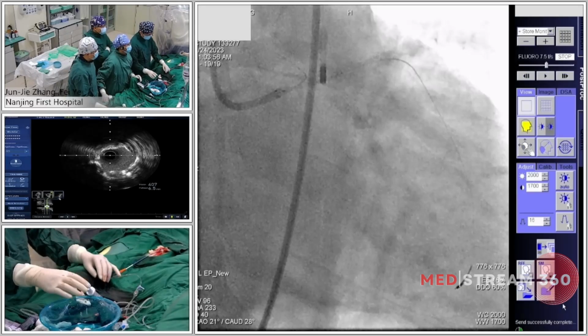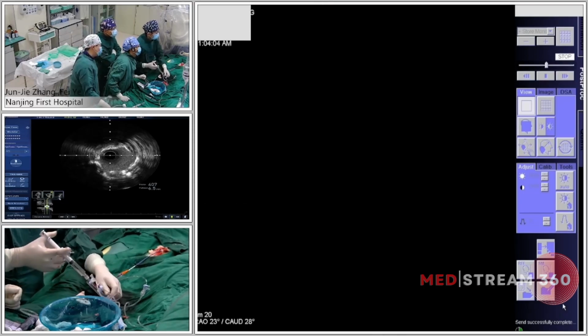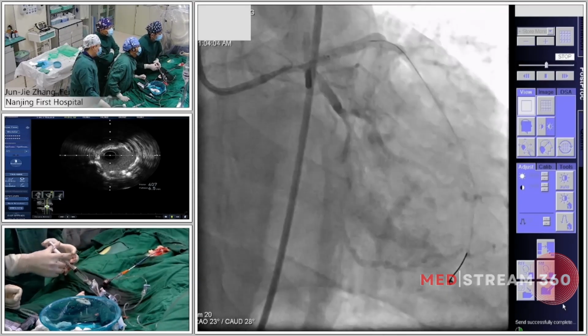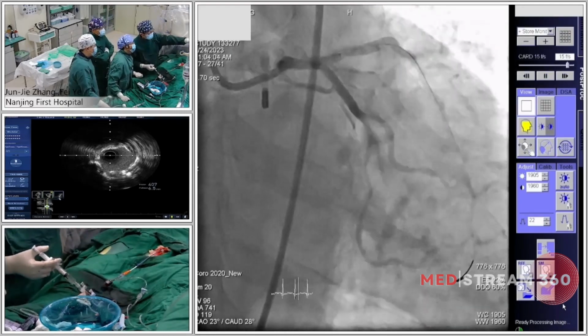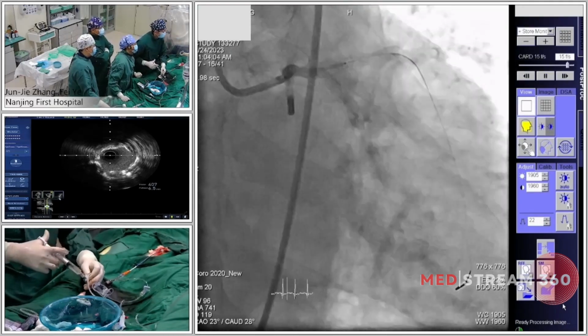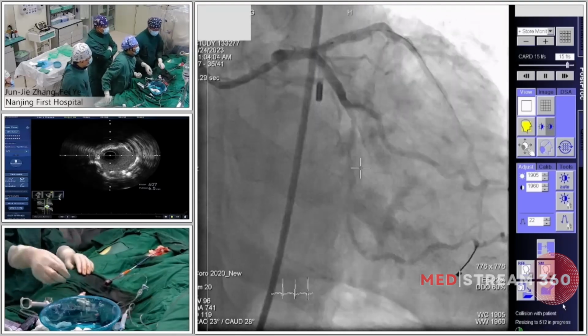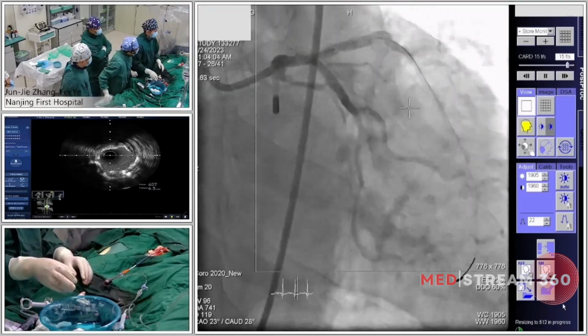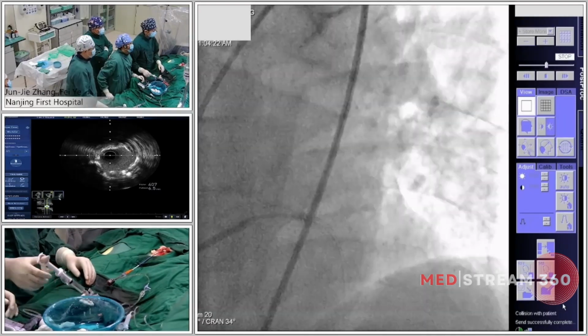I see. Overlap. Definitely overlap already. We can see the angulation. How about the ostium? Not sure. I think we still need a cranial view, epicranial, to check the stent fully covers the ostial left main.